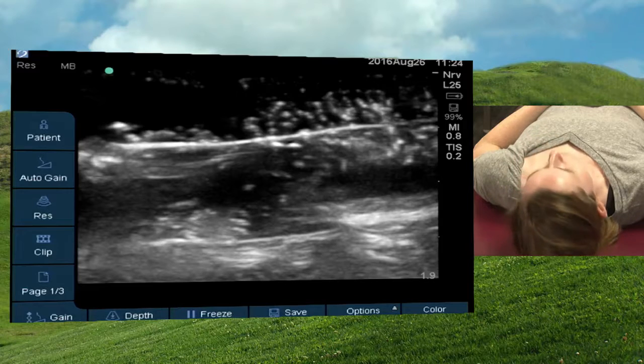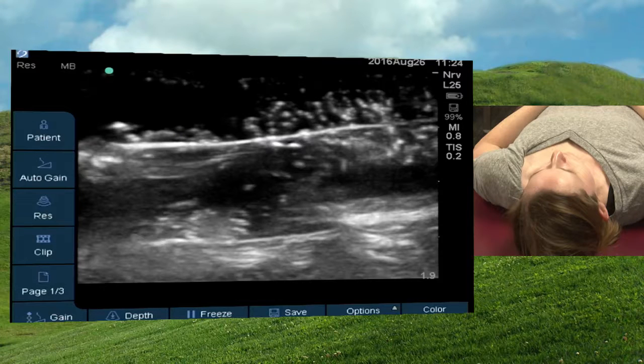No, I've never had an embolus with an EJ catheter. They tend to blow just like any other peripheral vein. They can and they will. They'll get big and puffy if you miss or blow it, just like it will down here on your hand. But I've never been caught by one of the internal medicine docs who says, hey, you gave my patient a PE from the external jugular catheter that you started.